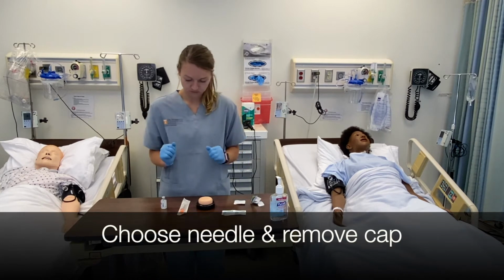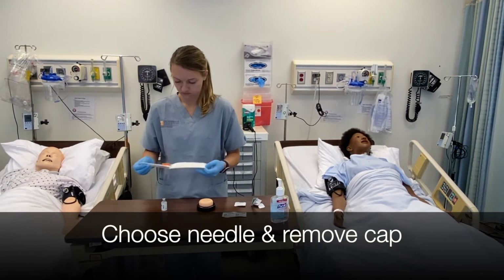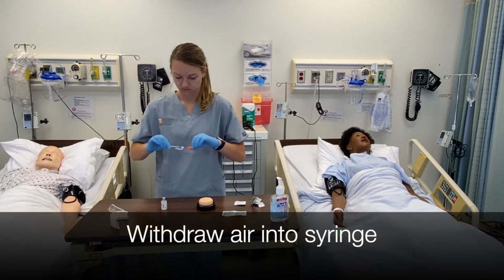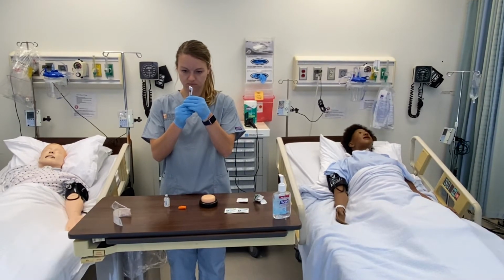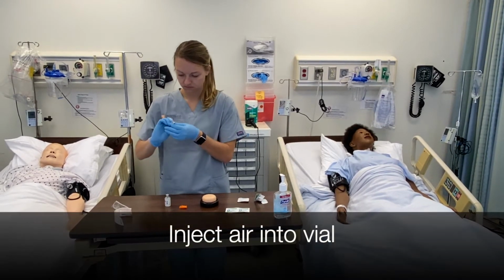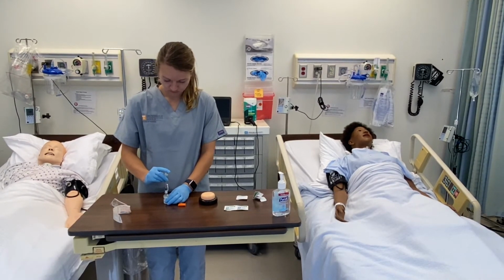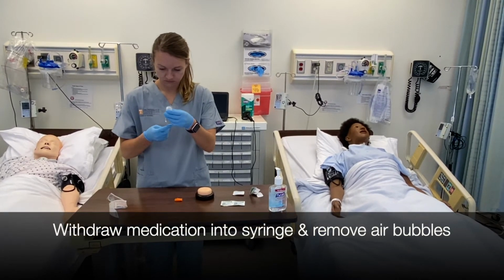Choose correct needle and syringe for administration. Remove needle cap, maintaining sterility. Withdraw correct amount of air into syringe, and inject air into medication vial. Withdraw correct amount of medication into syringe while removing any air bubbles.